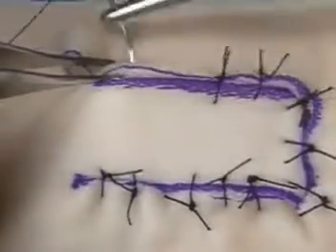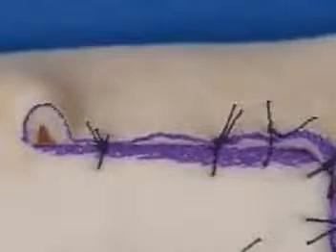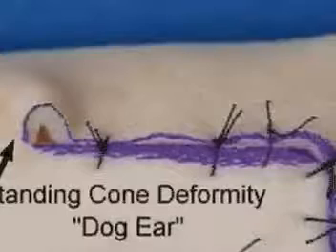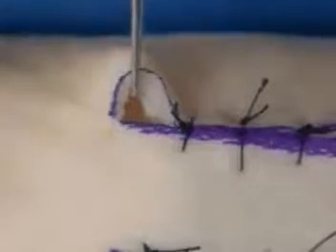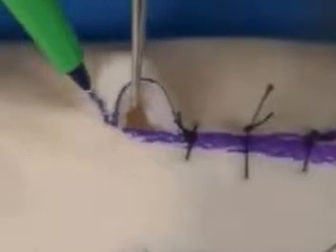On the upper flap, we have closed it so that the skin is closed in an even manner, resulting in a standing cone deformity at the inferior aspect of the flap. The standing cone deformity excision is always done away from the flap pedicle. A single hook is placed in the dog ear, and the triangle that is formed can easily be seen.